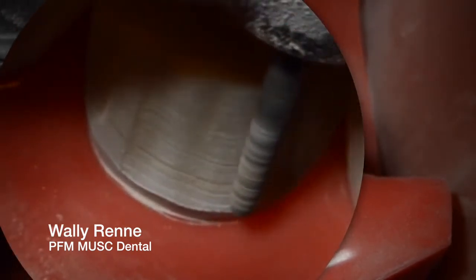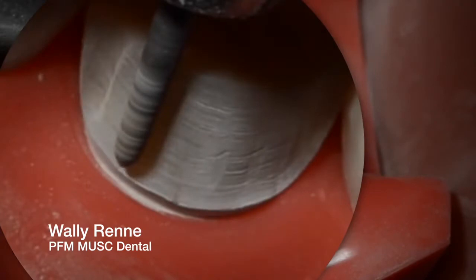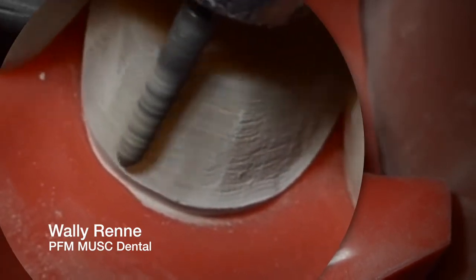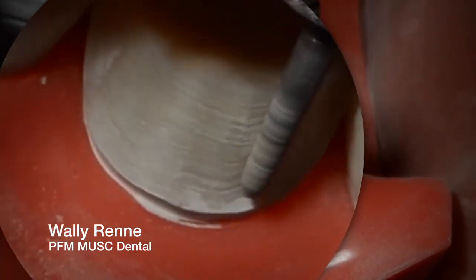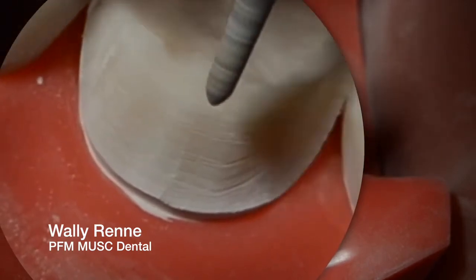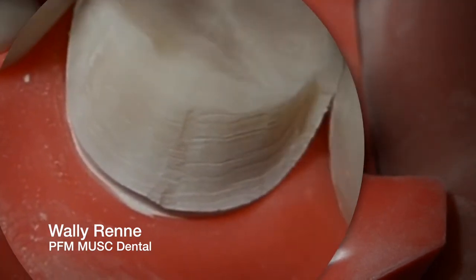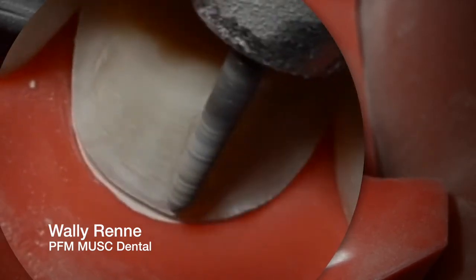I'm just trying to keep it about a half to one millimeter supragingival. Do not hit your tissue — that's just going to be bad. Get it relatively smooth, but don't focus so much on it at this point; you're just trying to do a rough cut gross reduction right here. By doing this little functional cusp bevel at about a 45 degree angle, I'm just ensuring that later on I can keep that in my preparation. Now I'm just fine-tuning that finish line again.